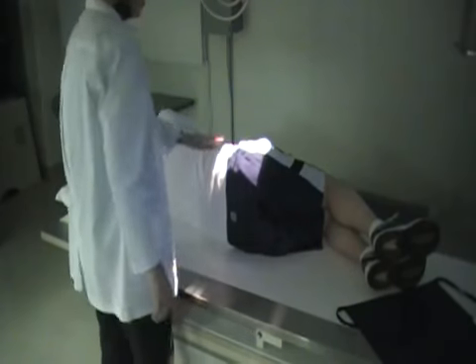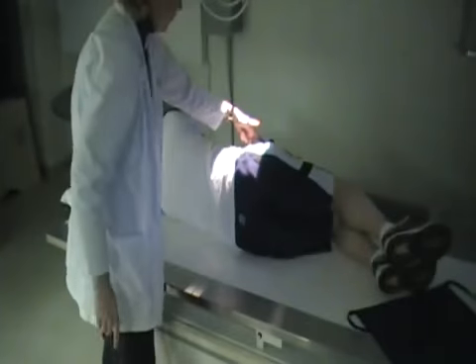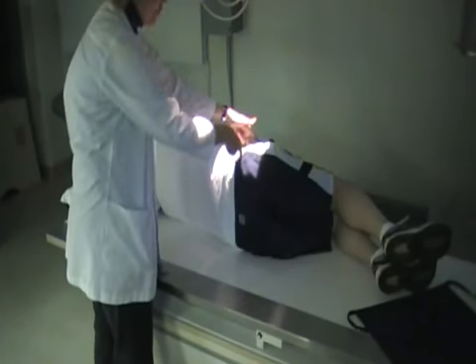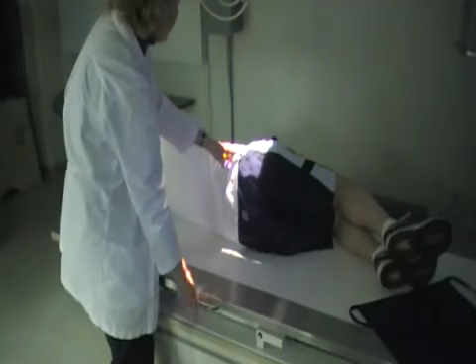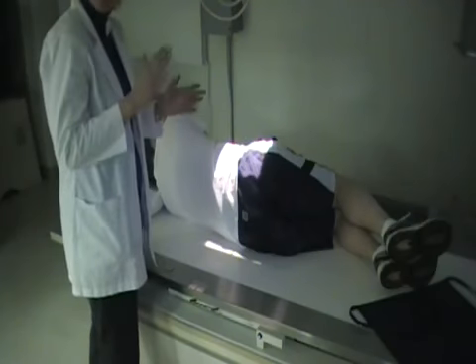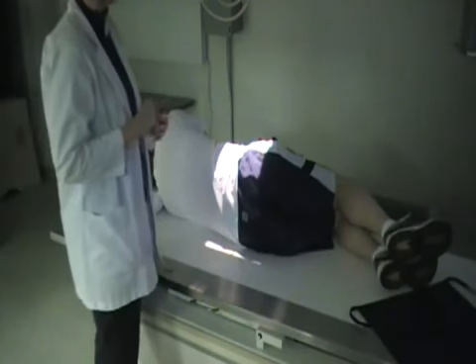Now, when you're doing the lateral sacrum coccyx, you're going to have to palpate the ASIS. So here's the level of the ASIS. So I'm going to center right where my finger's at with that transverse line. Now, this line going up and down, you want it to coincide with 3.5 inches posterior. So I'm going to move that back, and you can see how this brings the light to the very posterior edge, and you see a little bit of light here directly on the table. But because the sacrum and coccyx curves back, it is going to be in the most posterior portion of the vertebral column. Okay, so right now we're centered right over the sacrum.